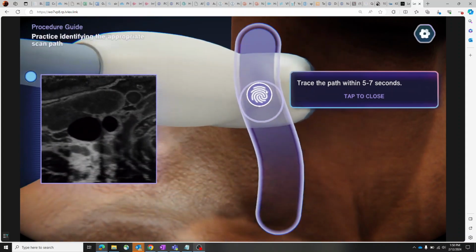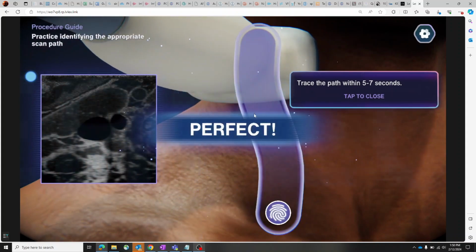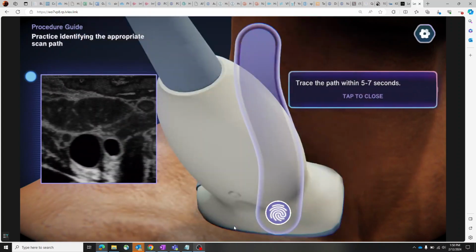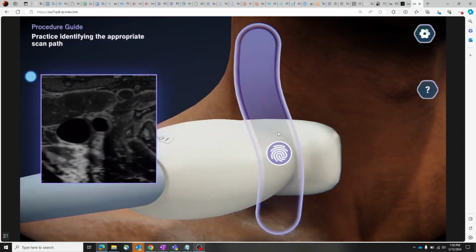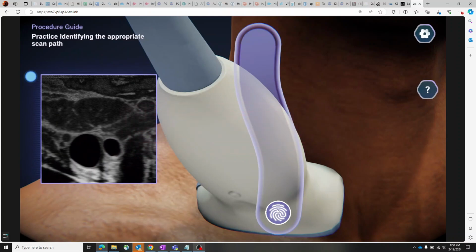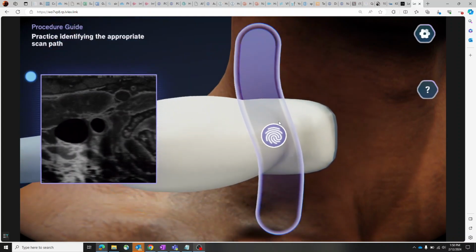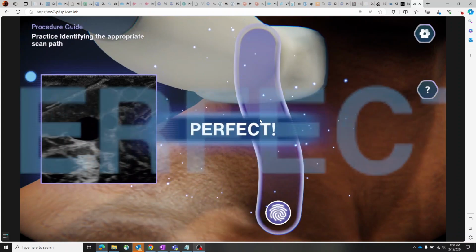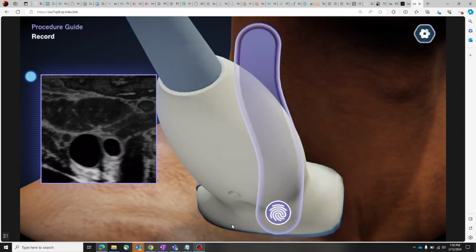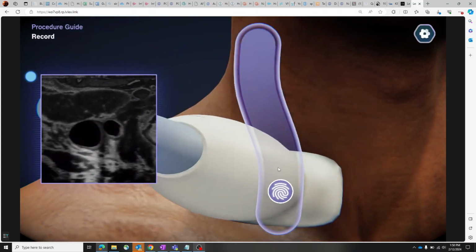What's your passion about this particular chapter? Because I feel like it's a unique opportunity for a game to provide the ability for you to review scans and load images before you see it, and not only see them, gain more experience with it, but also argue for why something is better or worse, giving us an opportunity to basically tell our audience, our players, what to look for and self-learn how to assess themselves and how to assess their homework when they do it.